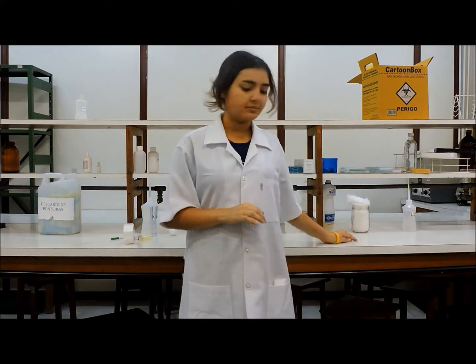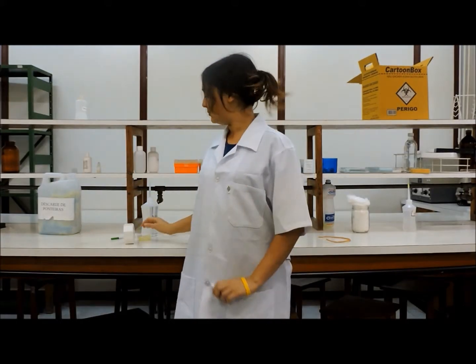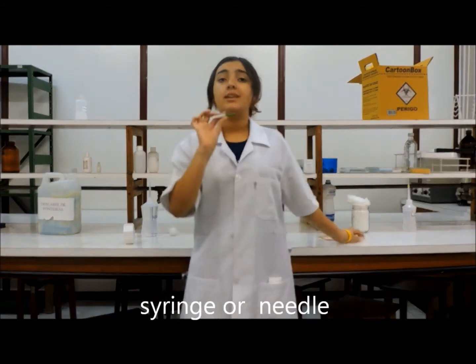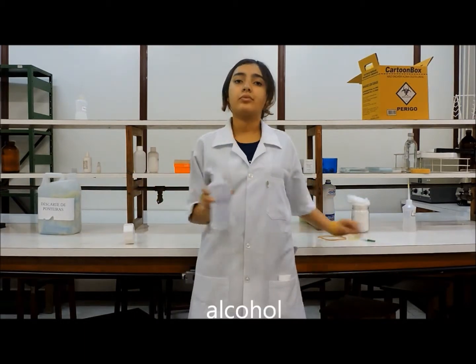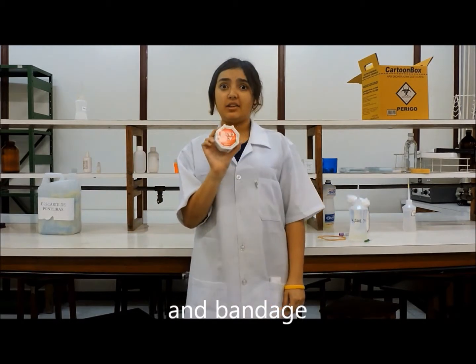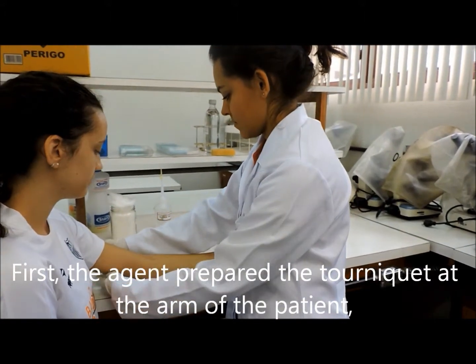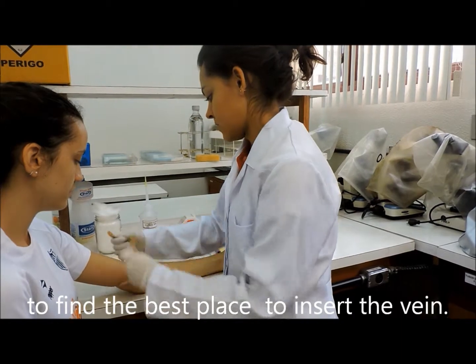tourniquet, vacuum tube, adapter, syringe or needle, alcohol, cotton, and bandage. First, the agent places the tourniquet on the arm of the patient to find the best place to insert into the vein.